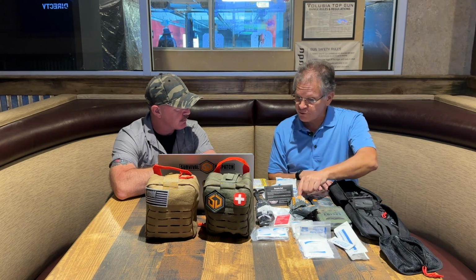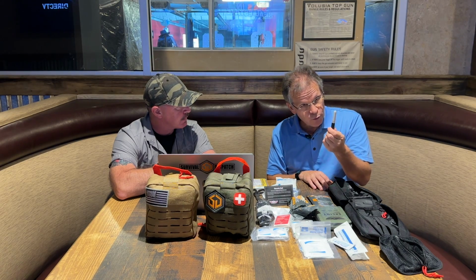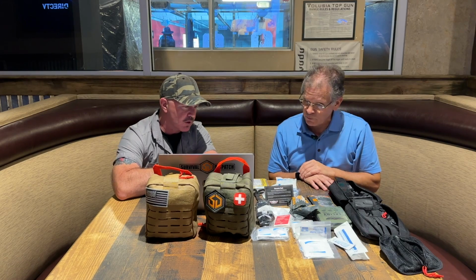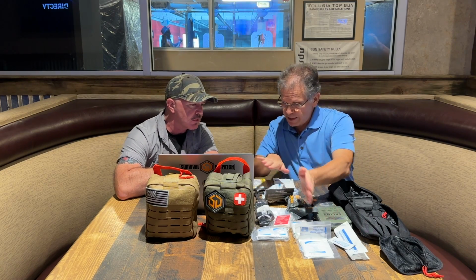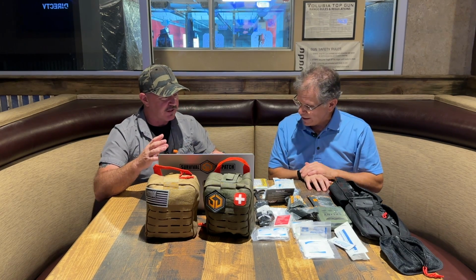Okay, so it can be on for longer, but if you're getting to where there's paramedics or someone else, they're going to want to know what time you put it on. So this is important to put that on so that you document what it is. So this is the basic kit here. Okay. Any questions on any of the stuff I just ran through real fast?